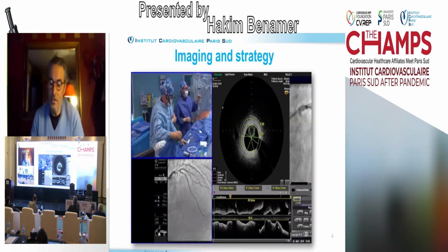Okay, we can discuss what we have as information with intracoronary imaging, if you want.